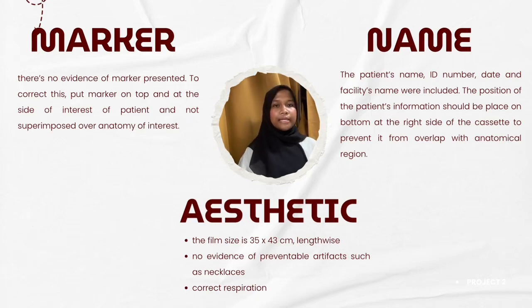For the last one is the name. The patient's name, ID number, date and facility's name were included. The position of the patient's information should be placed at the bottom right side of the cassette to prevent it from overlapping with the anatomical region.